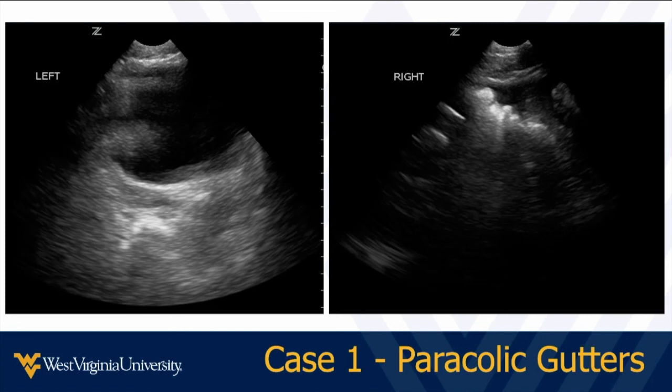It only takes an extra 2 seconds. Okay, so you can do this quickly. If you do it all as kind of one continuous exam from above the diaphragm down the paracolic gutter, fanning through as you go, this takes 10 seconds on each side.